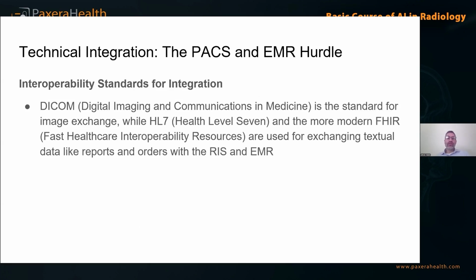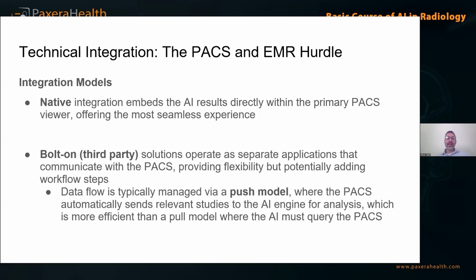Technical integration, so DICOM, HL7, RIS, EMR, how is this going to happen? Is it a native integration with PACS, a seamless experience, or are you going to bolt it on? It's going to be sort of a push or pull model with the PACS system and the server. All of these are really important, especially for me as an informaticist. If I'm going to bring an AI tool into my practice, I want to know that it works seamlessly, works in the background, and is not obtrusive.